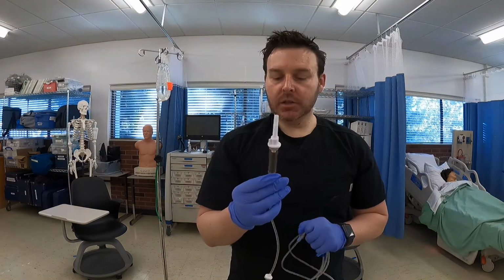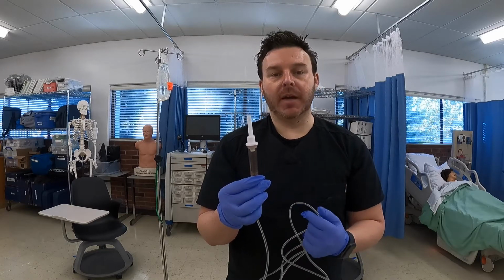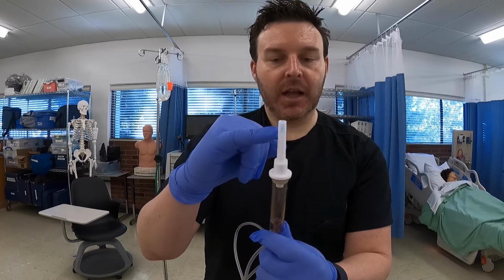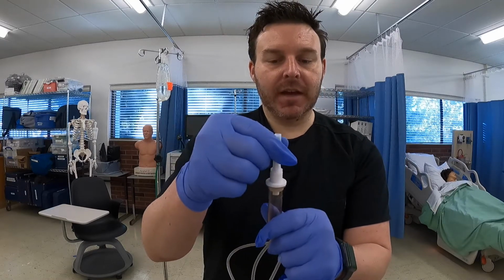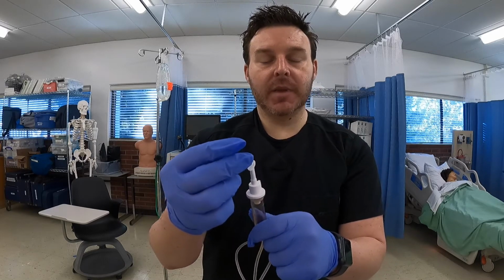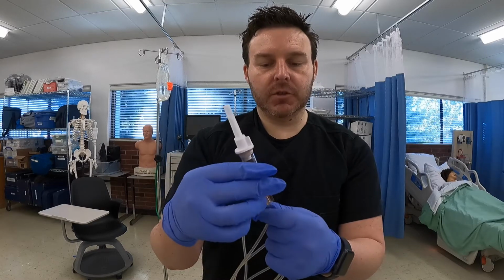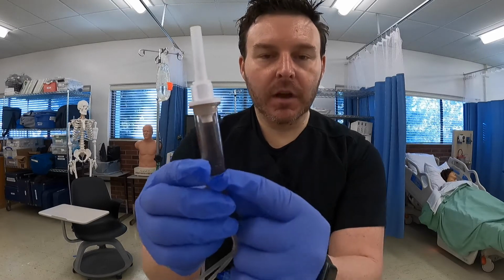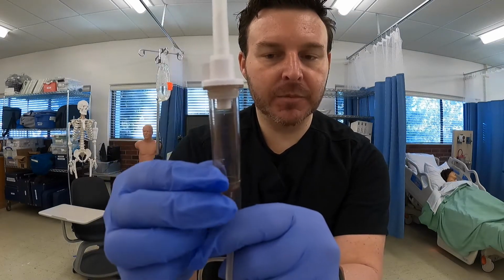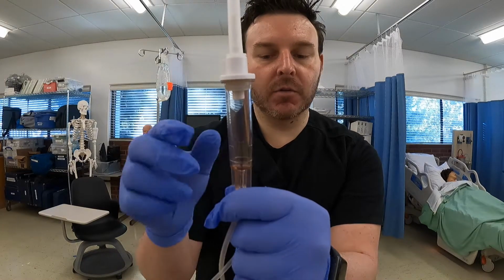Okay, so now we're going to prepare our IV tubing so we can go ahead and spike our bag. A couple things that you want to know before you do this is you have this plastic tip here, and that is covering the spike of the tubing. So you want to keep that on to make sure you're maintaining sterility during your priming process when you're first starting out here. I don't know if you can see that little mark right here, but this is called the drip chamber, and that is how high we're going to want the fluid to go in. It's about 1/4 of the way up.